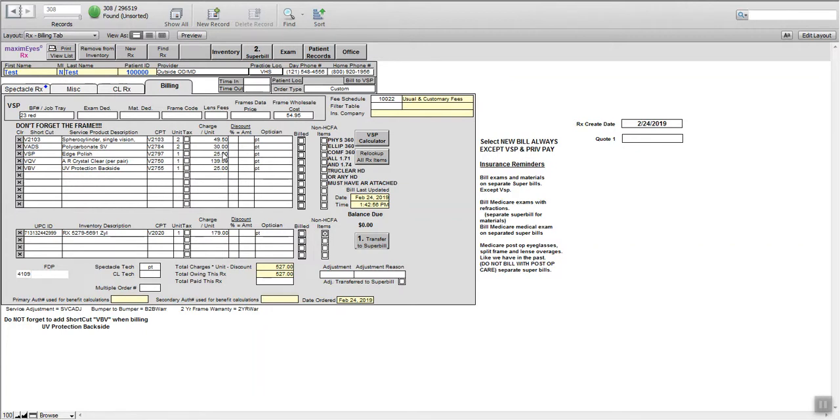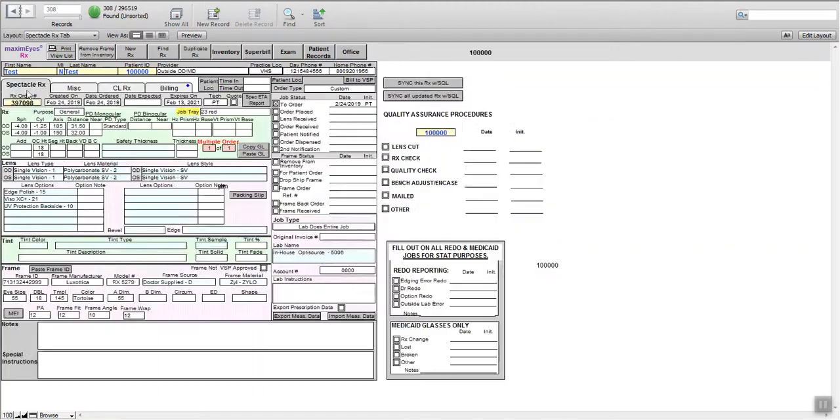Edge polish, crystal clear, and the ultraviolet protection. Here's our frame. We've taken all of our measurements, so we're good there. Put our initials in.